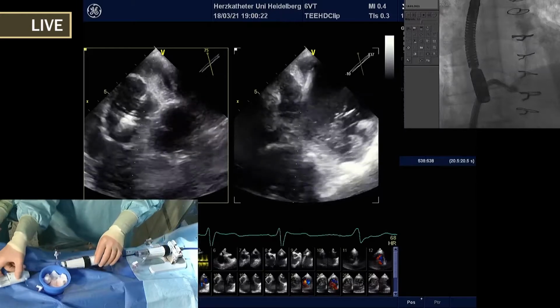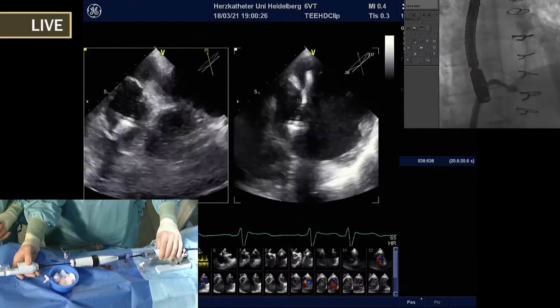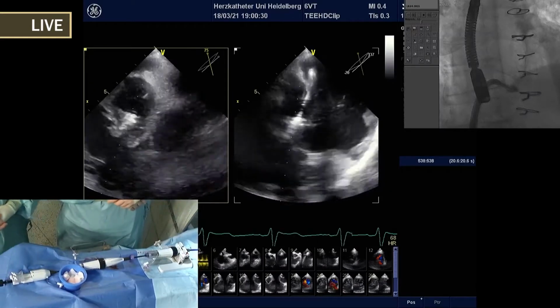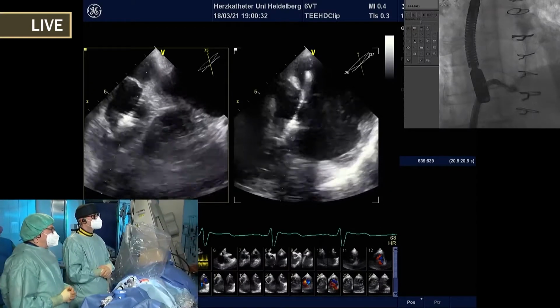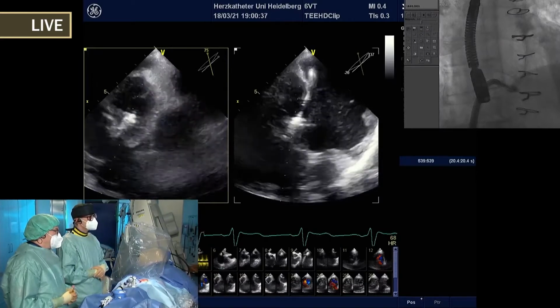Of course, you can do that, but you have to overflex; anterior will be easier here. So you need some anterior movement to get off a little bit with the shoulder in the right image, to get away from the septal hugger a little bit, and then you have an optimal position already.